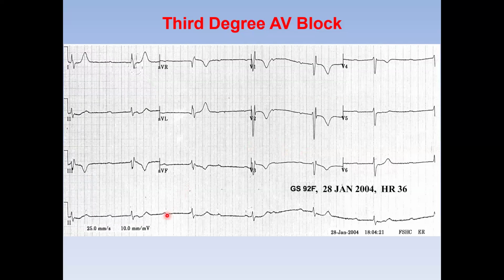This is another one. If you look suddenly here, you may think, oh, maybe this is conducted. But as you look at the whole strip, you can see that it's totally dissociated.